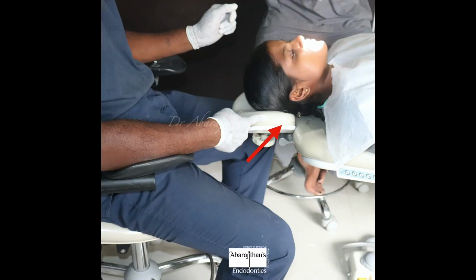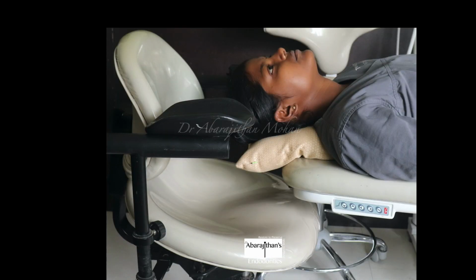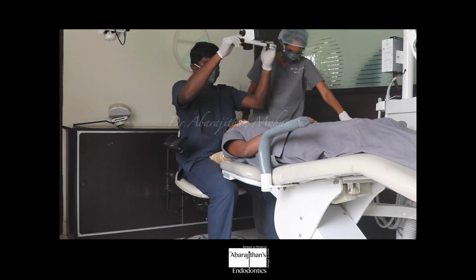So what we do is we pull out the headrest of the patient. So once the headrest is removed, now a neck pillow is given for the patient so that the patient is also comfortable. And once the headrest is removed, you can see that the operator's stool can now go very close to the patient, and the operator's thighs can be below the chair. After this, now the operator is being seated comfortably very close to the patient without the need for him to bend forward, and now the microscope is pulled to position again.